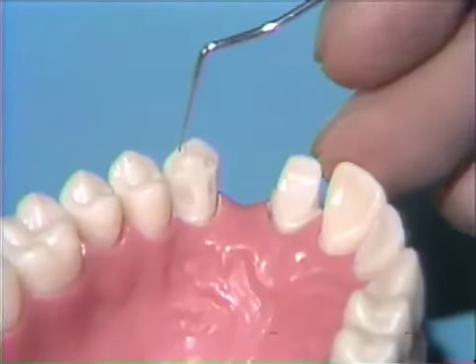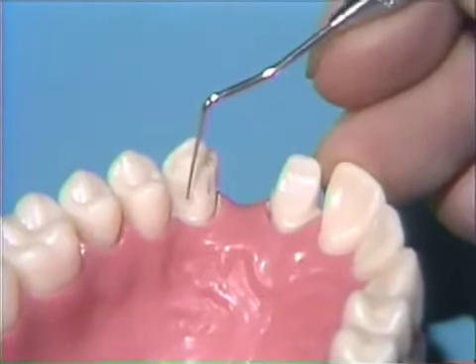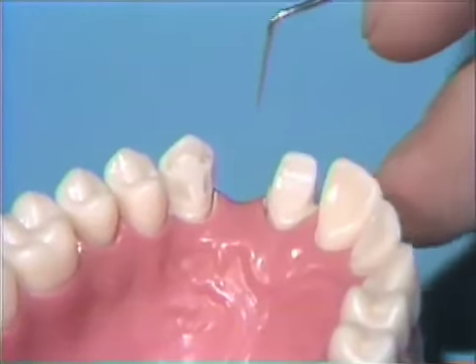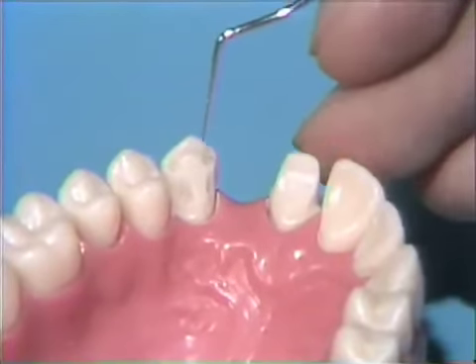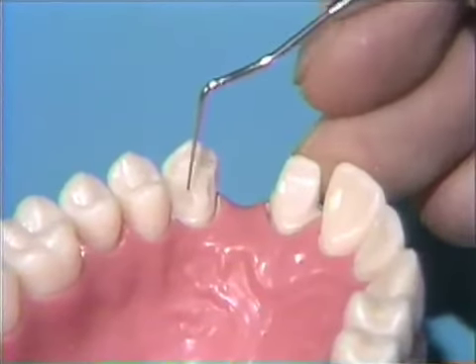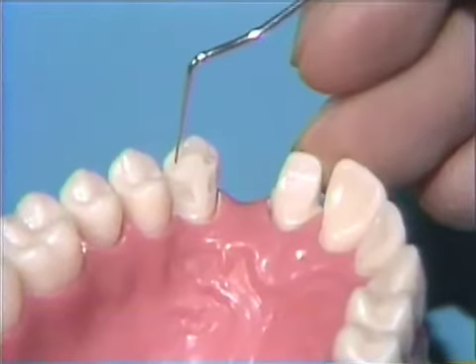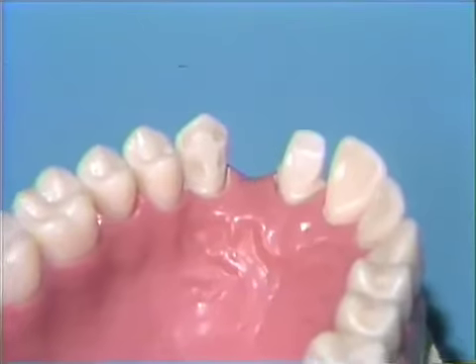But before we go to that, we have to drill the two incisal pinholes and the cervical pinhole so that they all line up in the same line of draw and also line up with the porcelain fused to metal preparation. The incisal pinholes are going to be placed at a depth of two and a half millimeters. The cingulum pinhole will be three millimeters. To begin with, we're going to start with the distal incisal pinhole and drill it to its depth.